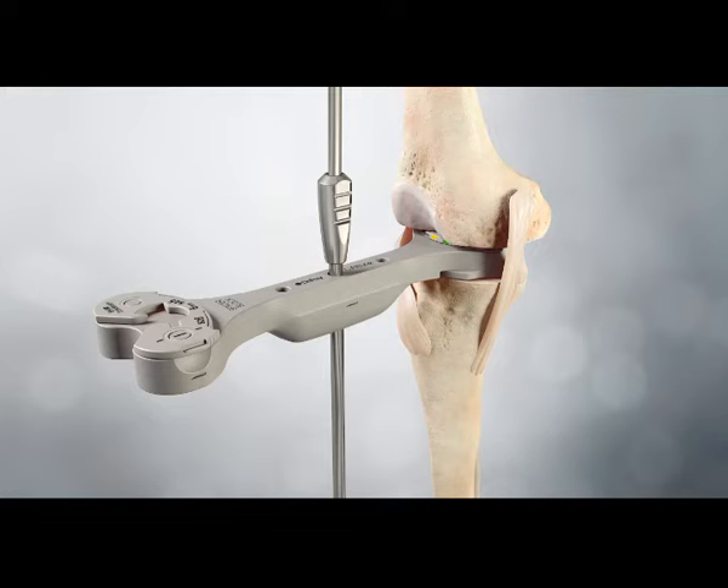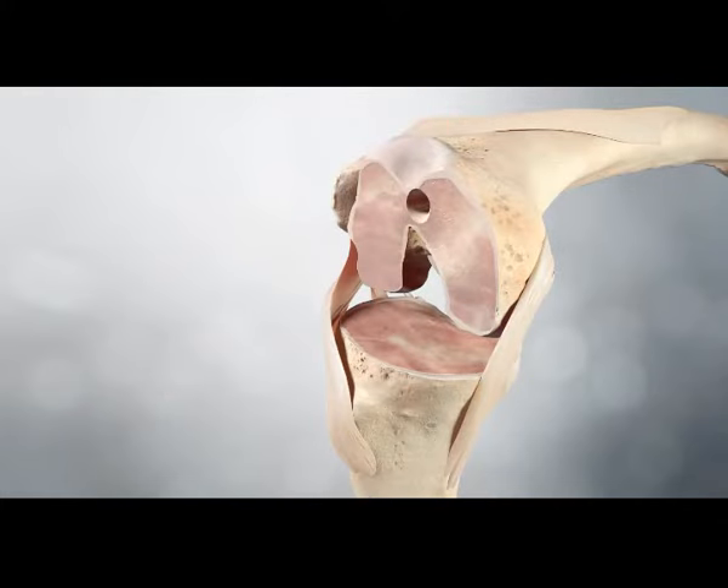A gentle varus valgus stress test may be performed with the spacer block in place. Typically, 1mm to 3mm of opening both medially and laterally is desirable. Measured or balanced sizes are available depending on surgeon preference. Both options are designed to work with the femoral finishing guide.